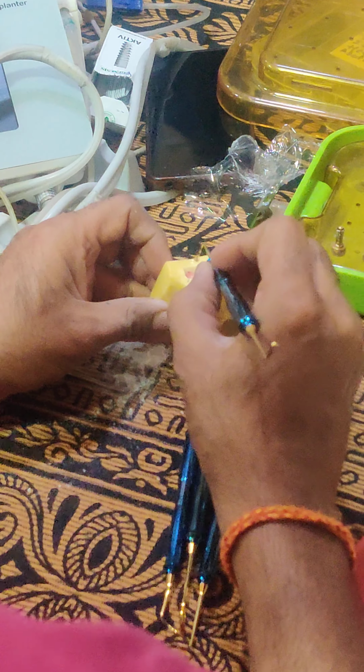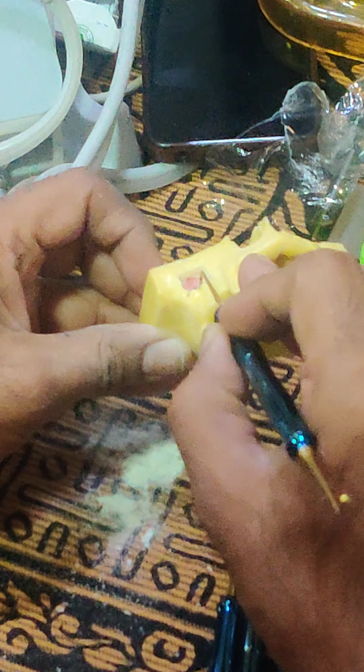So there is no specific name for these instruments. One is having a flat end. First I am going to separate at the borders. What I am doing is I am separating and will pass it on later. It may not be visible to everyone, but I will pass it on to everyone. What I am doing is I am trying to separate it, not push it. This membrane is very delicate. It will rupture if you don't handle it very carefully.